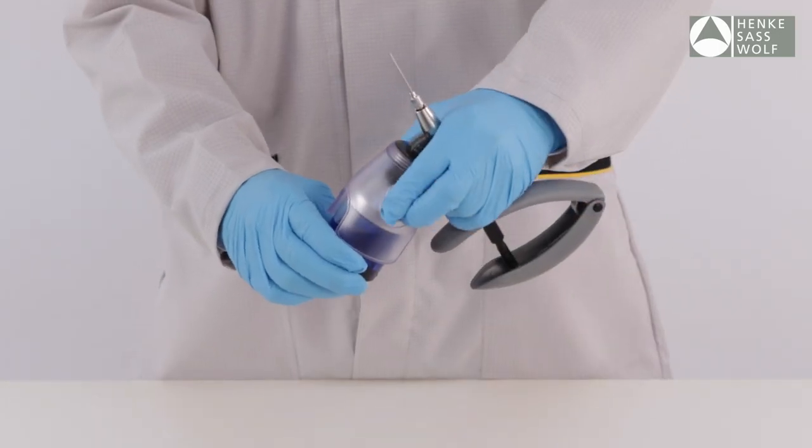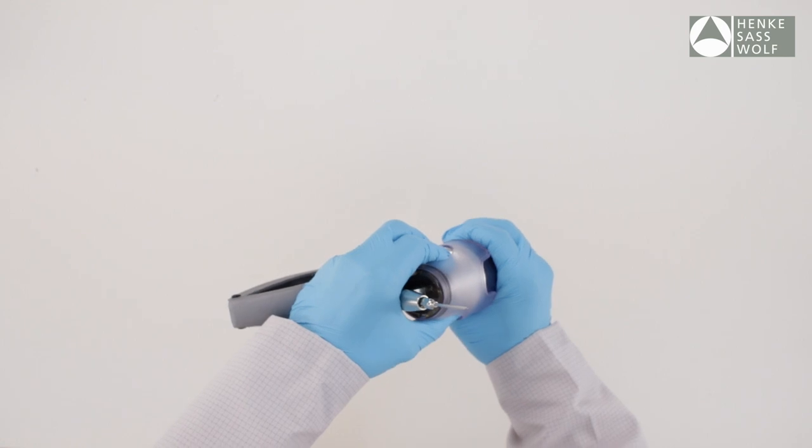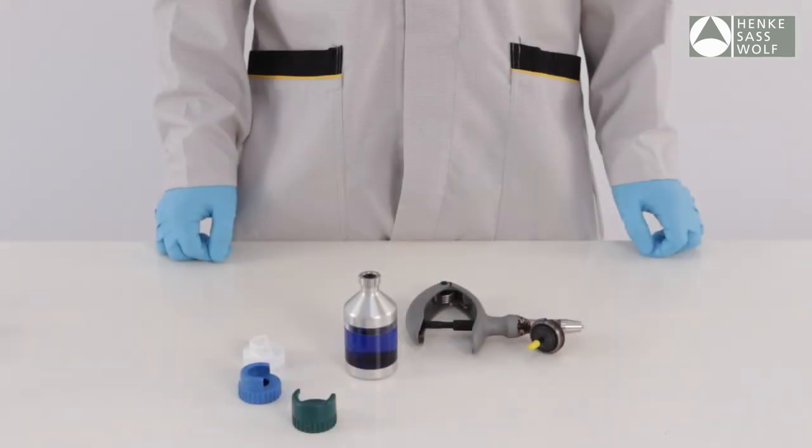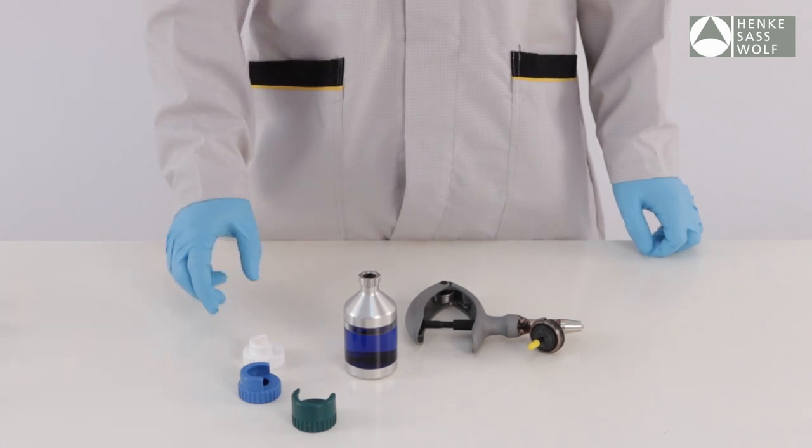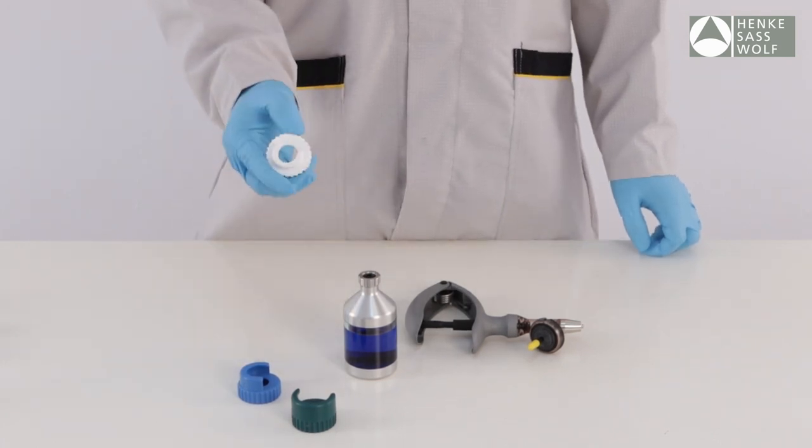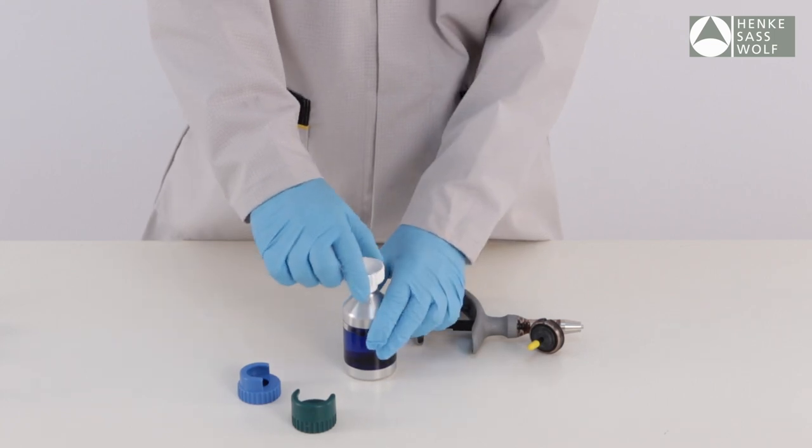Pull out the bottle by using the grip hollow on both sides of the bottle. For various bottleneck sizes, Henke SAS Wolf offers the Ecomatic with a universal adapter set. Select the corresponding adapter for the bottle you want to use.